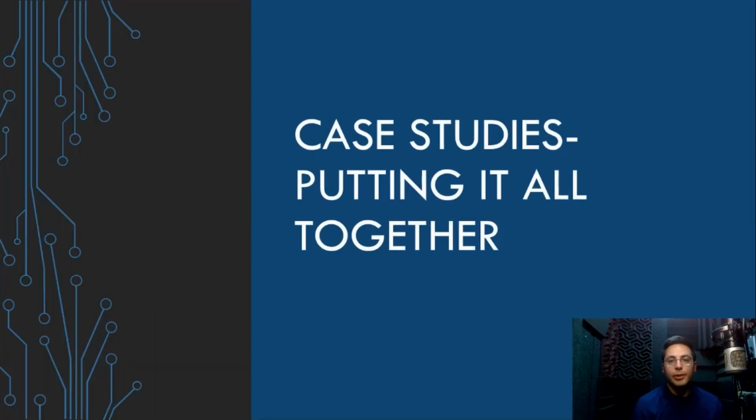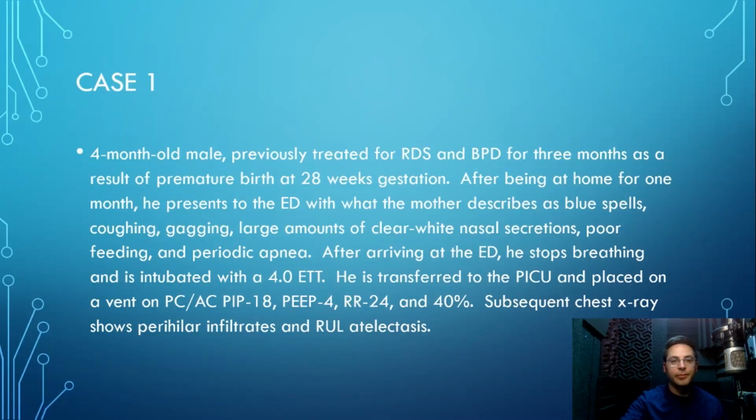So I'm going to go over a few case studies so that we can put everything that we've learned together and try to really get into the nitty-gritty of what's happening on these particular scalars and loops.